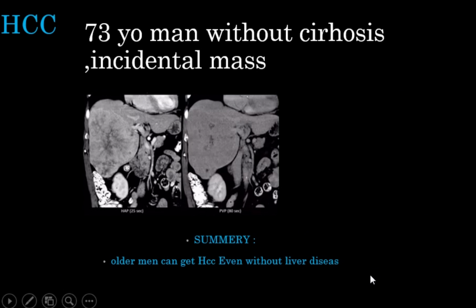And this is a huge lesion in an old man with a normal liver, but it came out to be hepatocellular carcinoma, because being an old male is a risk factor for having HCC. Just because he's a male, it's very risky.